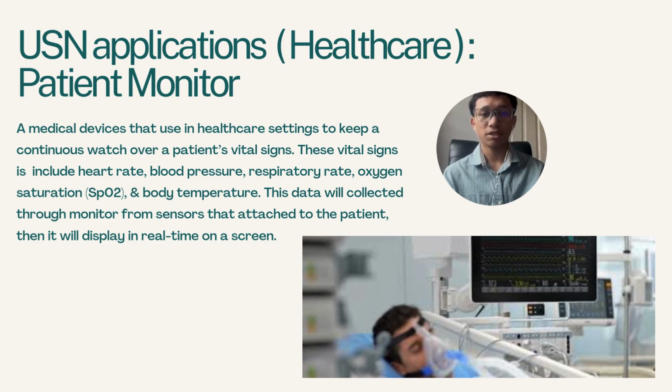One application of USN in healthcare is a patient monitor. A patient monitor is a medical device used in healthcare settings to keep a continuous watch over a patient's vital signs. These vital signs include heart rate, blood pressure, respiratory rate, oxygen saturation, and body temperature. This data will be collected through monitors from sensors that attach to the patient. Then it will be displayed in real time on a screen.